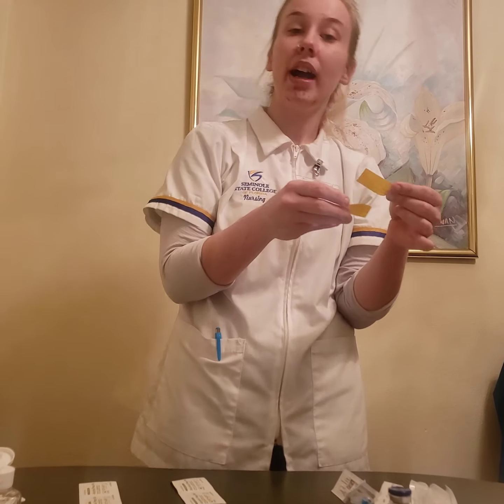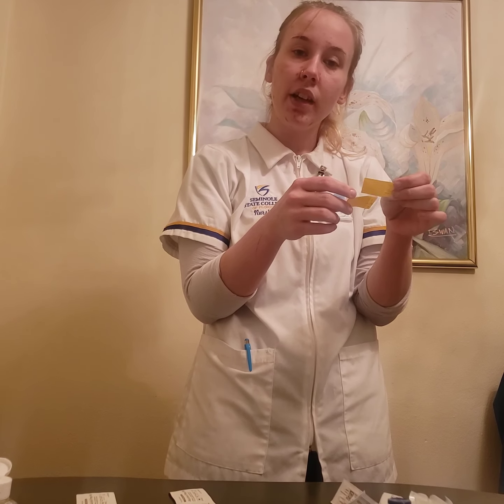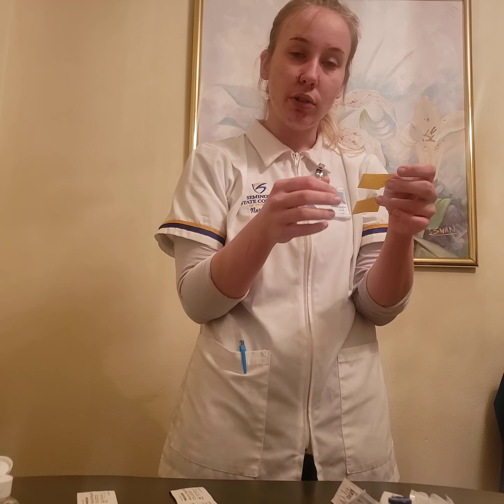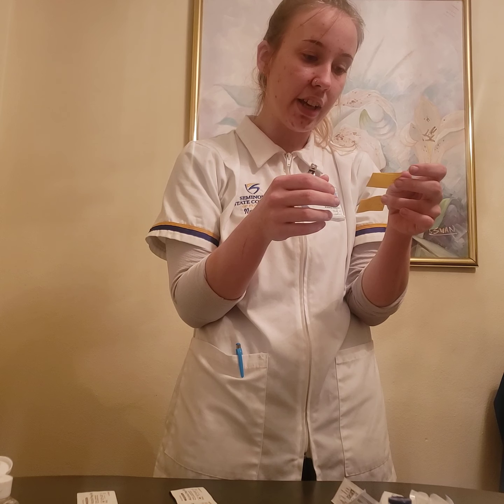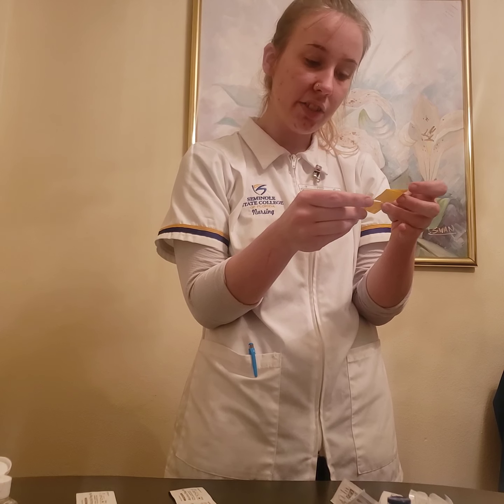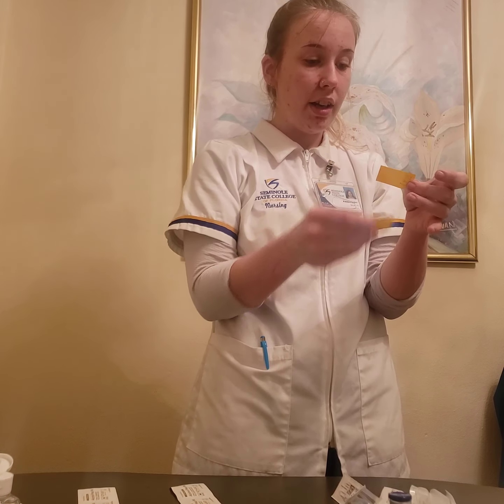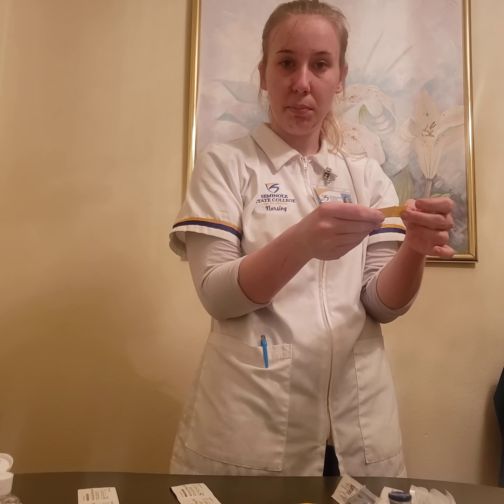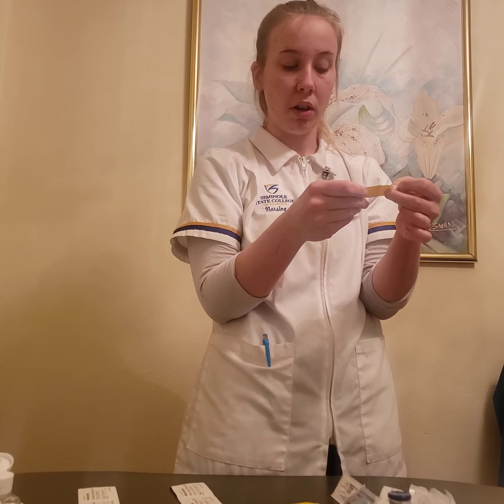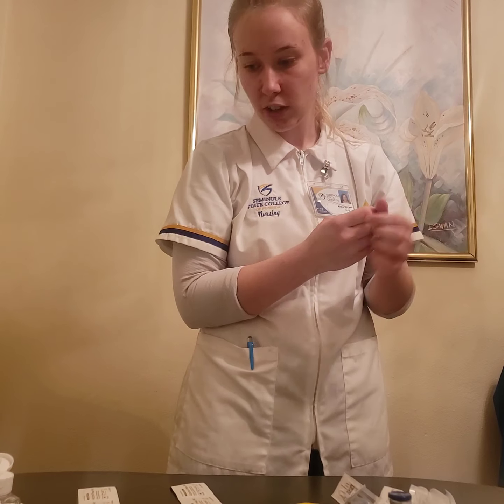And I have those labeled with my initials, the initials of the patient, Anna Pawlowski, her date of birth, today's date, the time, which is now 1300. I have the dose for each, the name of the drugs, and the volume. So for the flu vaccine, I have 0.5 milliliters. It's given today at 1300 to Anna Pawlowski, IM. And then I have my cyanocobalamin for Anna Pawlowski today at 1300, and I'm going to be giving 500 micrograms or 0.5 milliliters, and that is going to be subcutaneous injection. So that was my first check.